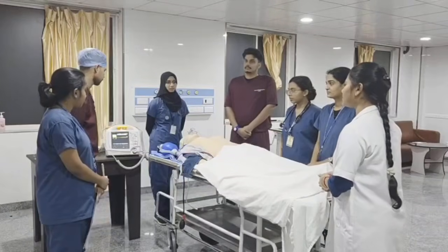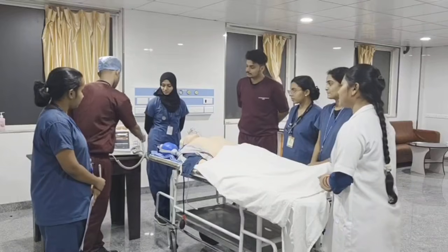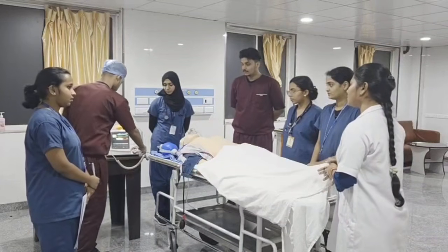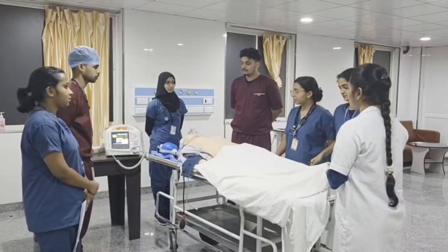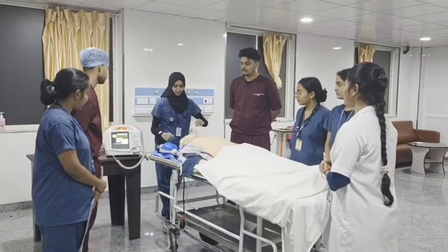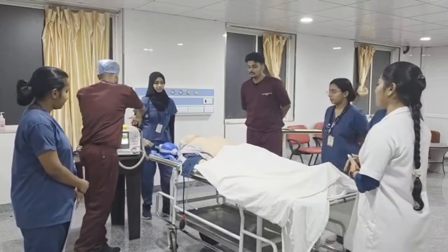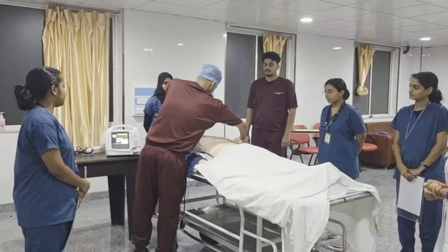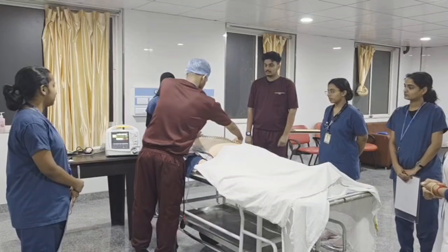Select 100 joules of energy. Turn on the sync button. Synchronized cardioversion. Charge it and keep it ready. Consent is taken, sedation is given. So we can proceed with synchronized cardioversion. Could you remove the oxygen source? You can proceed. Everybody clear? Do not touch the patient. Wait for 10 seconds.